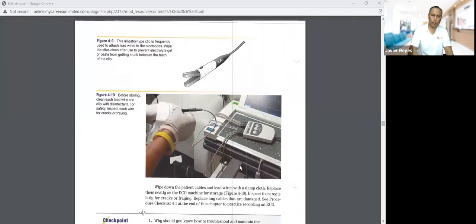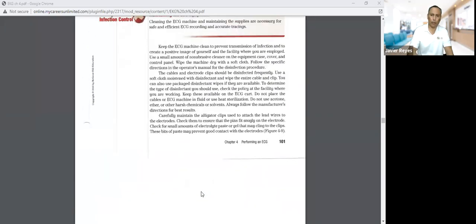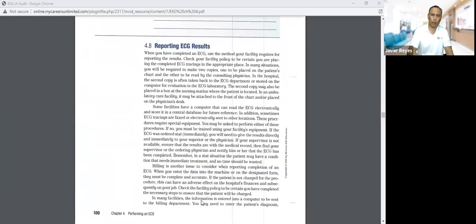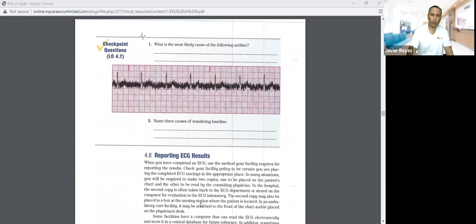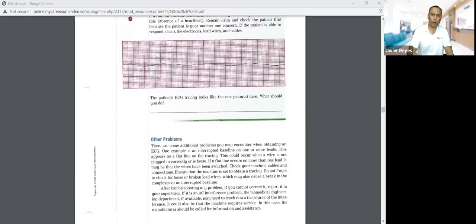See the picture of this machine? This is exactly the one that I have here. This is what we call the module, and then you got your wires that attach to the module. This module is attached to the machine. This connects here, and then you can see the monitor and the keypads right here. They're called alligator clips, and they're going to be clinging on to the electrodes. But I want to, okay, this is where there are different kinds of artifact that you're going to be dealing with.